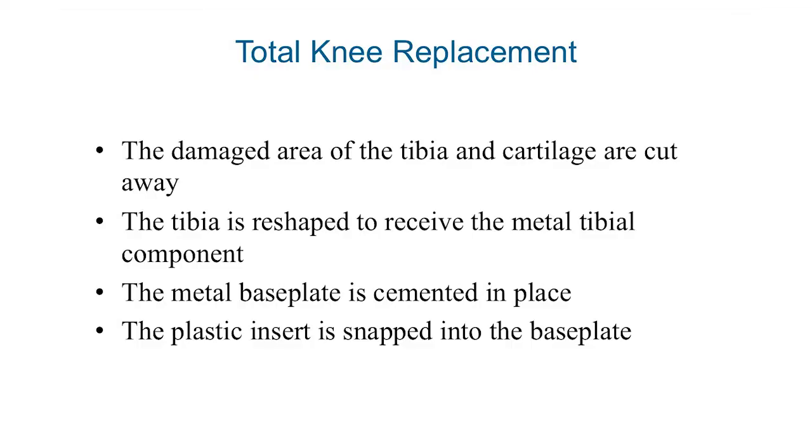So total knee replacement in general involves making a few cuts at the end of the thigh bone. We cut away the worn area, and we reshape it and make cuts around the bone. And we'll be passing around some models. We might be able to start that very shortly. And the models show the cuts that we make to accommodate the new spare parts.